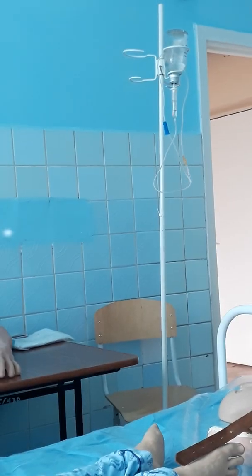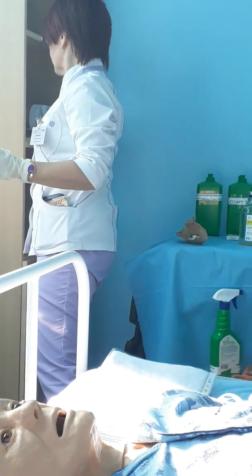For this type of AV, you need an additional needle for air.